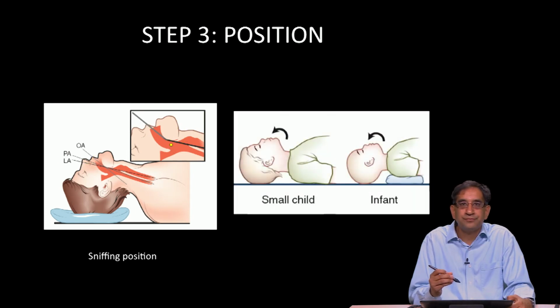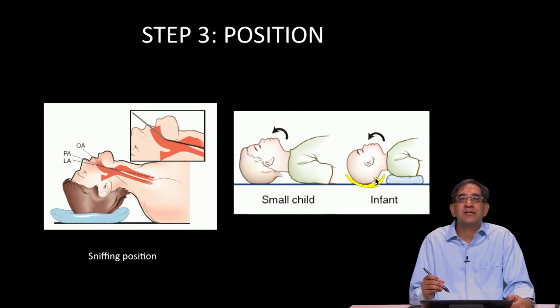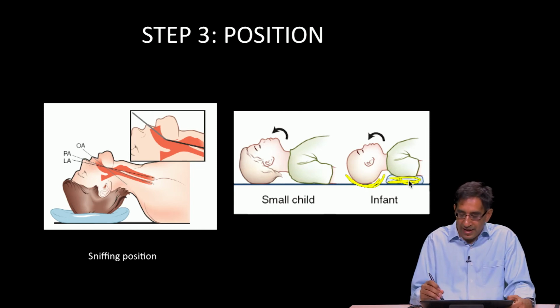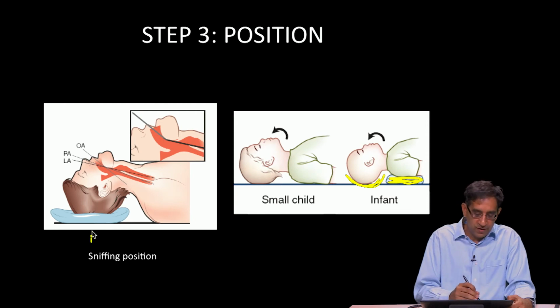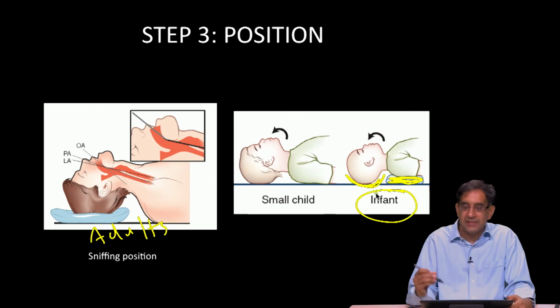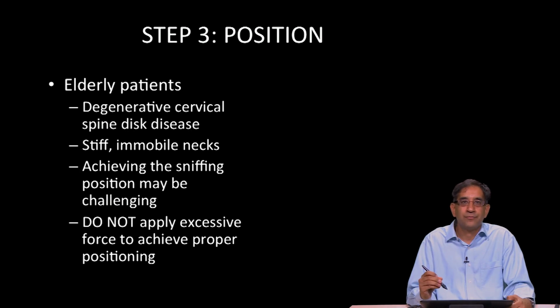In a small child, generally it's not necessary to use any towel underneath the head. And in infants, because they have this large occiput, we generally put that towel or rolled blanket underneath their shoulder blades. So for adults, it goes underneath the head. For infants, it goes underneath the shoulder blades. And for small children, generally, we don't need to use a towel.